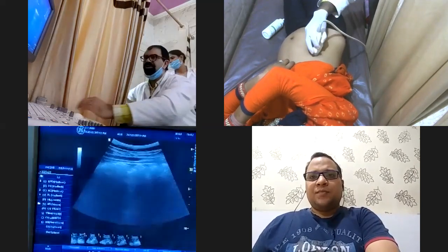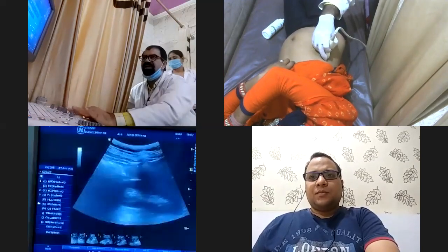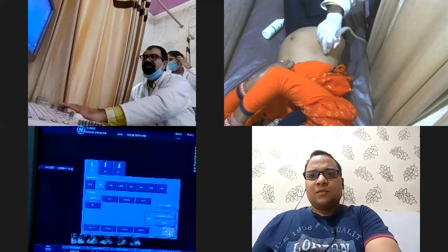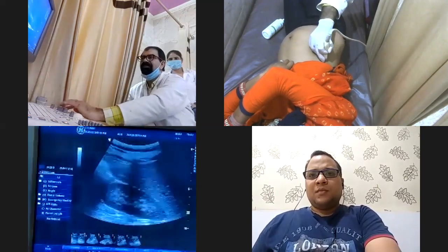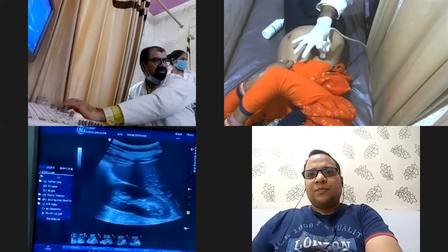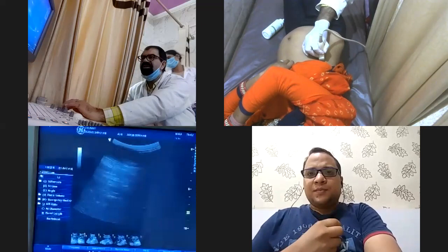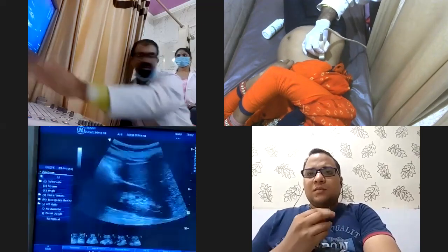Now I am asking the patient to distend the abdomen. Now this is the kidney over here. I am not teaching you the kidney for now. This is the kidney over here. Is this transverse or longitudinal now? See my hand also. So this is longitudinal. Now, the point is not to teach you the kidney here, but something else, which we will let you know.